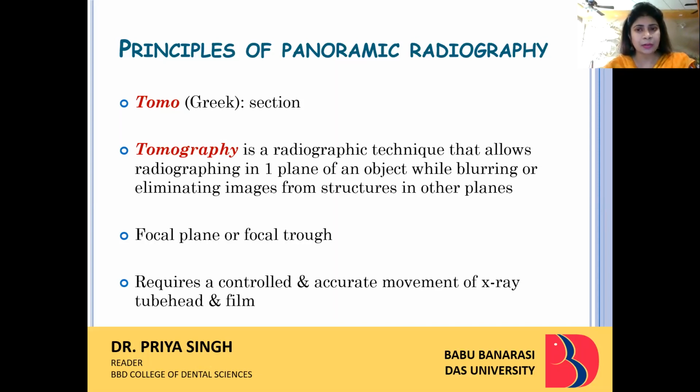Now coming to the principle itself, principle of panoramic radiography. As I have conveyed earlier, it has another name, that is pentomography. So why is it called tomography? Tomo is basically a Greek word which means any image which is taken in sections. So tomography is a radiographic technique that allows radiography in one plane of an object while blurring or eliminating images from structures in other planes.